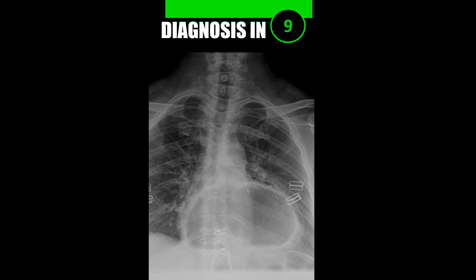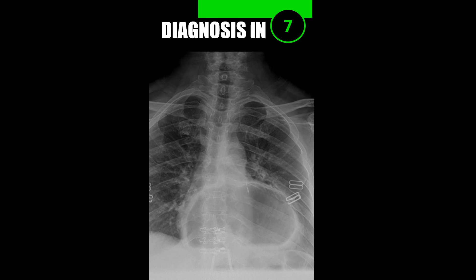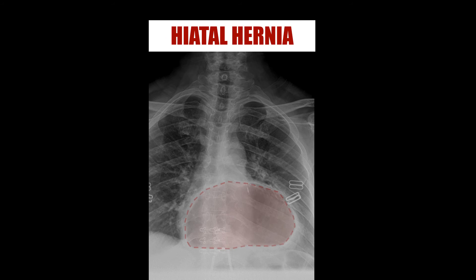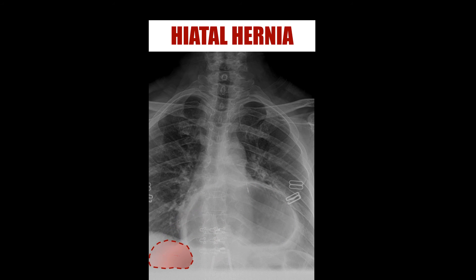Case number eight: this is a large midline hiatal hernia. The normal gastric air is under the left hemidiaphragm, but in this case you can see it overlying the heart. Compare that to where the normal gastric air bubble should be.